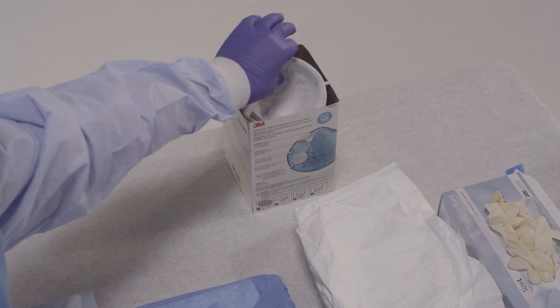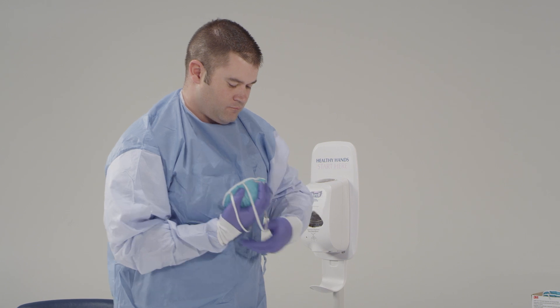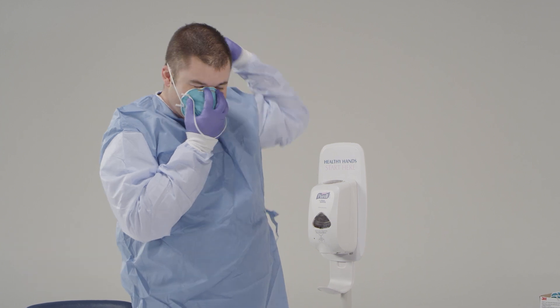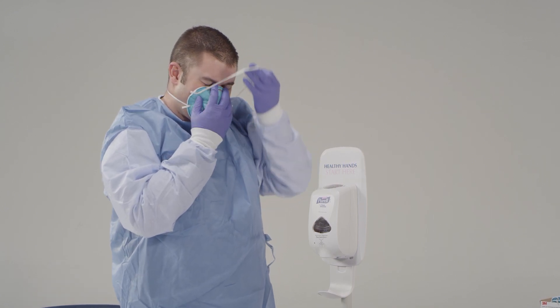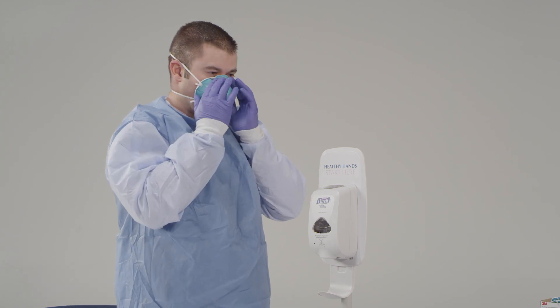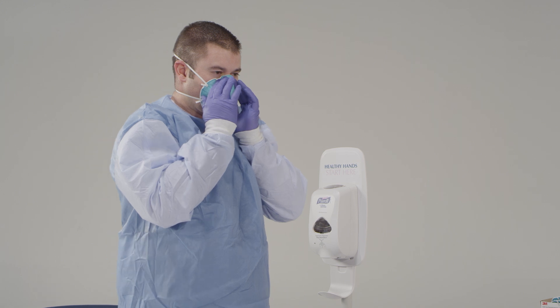Now we're going to put on the N95 respirator. Hold the respirator in the palm of your hand with the straps facing the floor. Place the N95 respirator on your face, covering your nose and mouth. Pull the bottom strap up and over the top of your head and put it behind your head below your ears. Take the upper strap and put it behind your head towards the crown of your head. Mold the nose piece over the ridge of your nose to obtain a tight seal. Always follow the manufacturer's instructions for wearing a respirator. Perform a fit check to ensure there is a good seal against the skin.